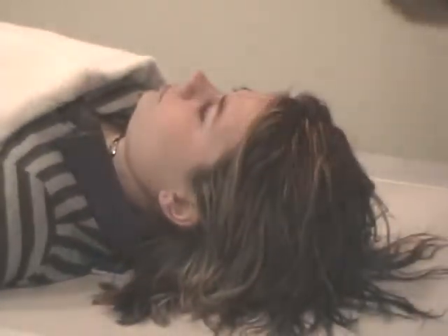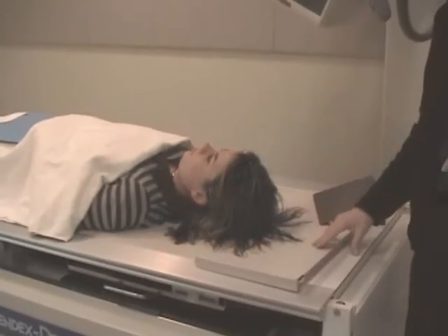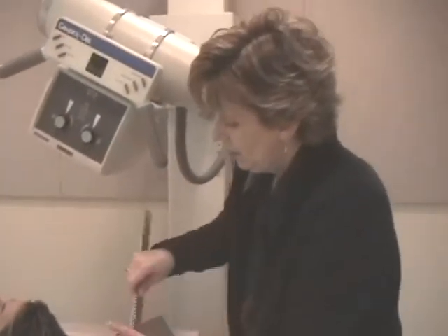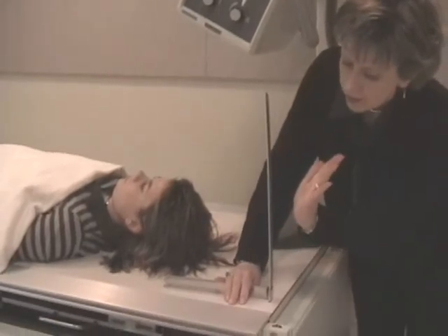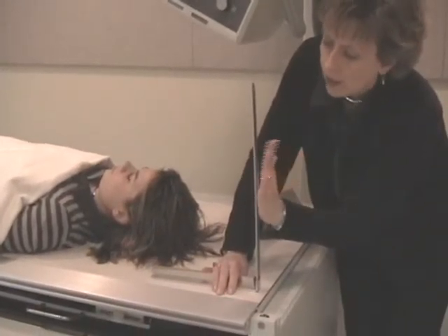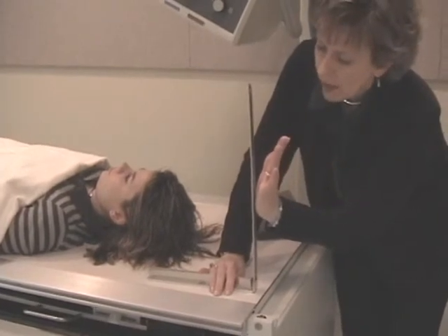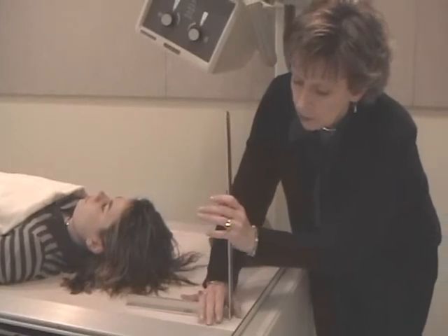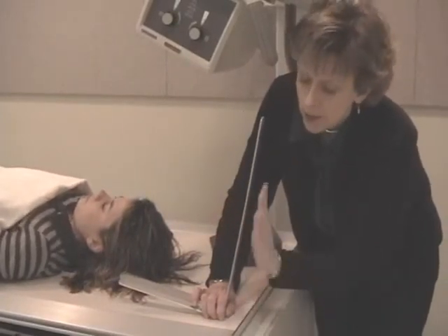And that is your AP axial. Okay? Now, I mentioned what if the patient cannot get their OML perpendicular. If the OML is perpendicular, that tube should be angled 30 degrees. Okay? I don't know if that's actually 30. I'm just giving you kind of a picture of what to think about. If the OML is not perpendicular, they can't tuck their chin, that would be the OML.